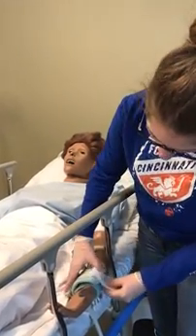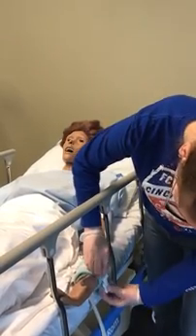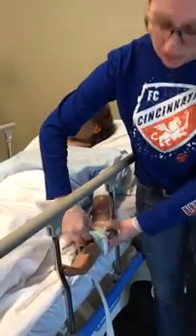So I'd wrap this around with the Velcro, and then I'd clip it, and then I would put 2 fingers in to make sure it's not too tight or too loose.